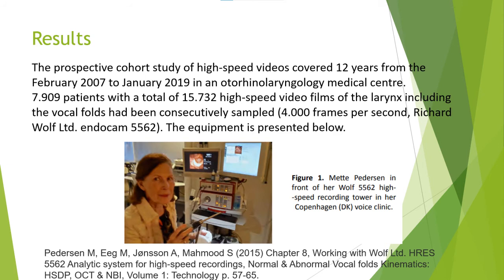The prospective cohort study of high-speed videos covered 12 years, from February 2007 to January 2019, in an ENT medical center. 7,909 patients with a total of 15,732 high-speed video films of the larynx, including the vocal folds, had been consecutively sampled. We have used the equipment from Richard Wolf, which is depicted here.